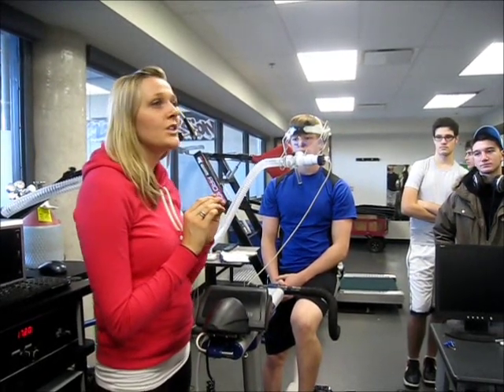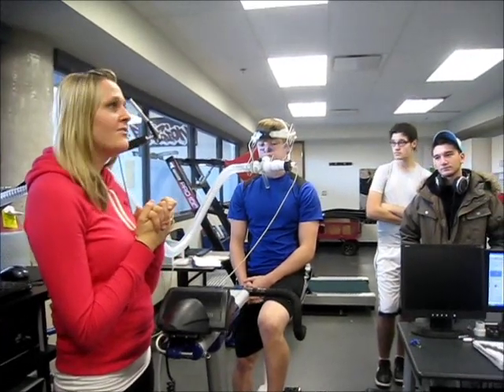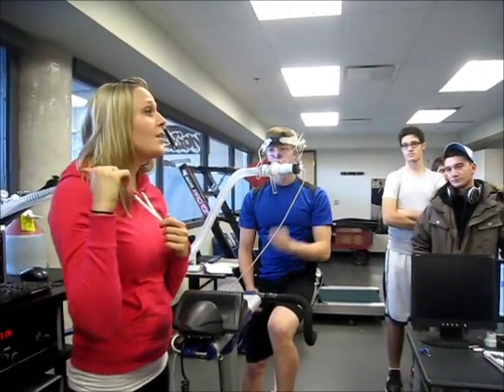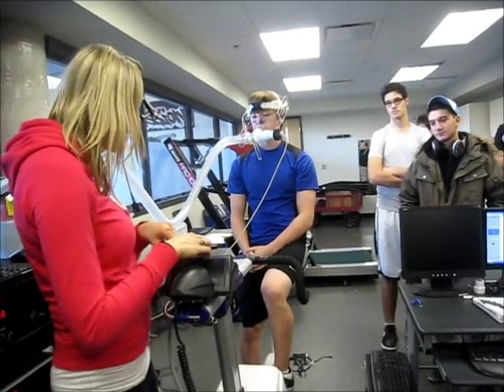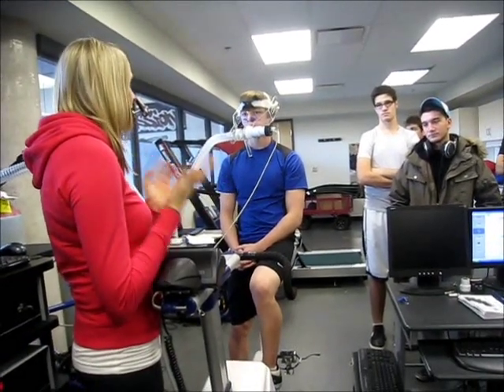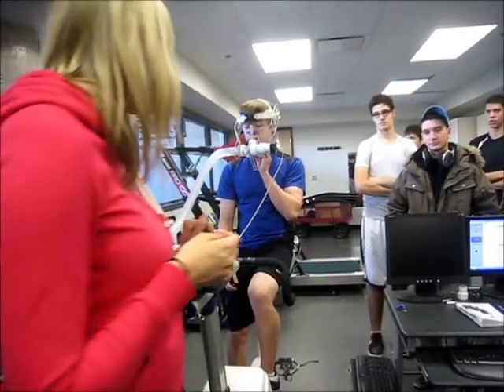After that, the workload is going to go up by 1 watt every 2 seconds, so it's going to be very gradual. He's not going to feel it at first, but eventually it'll start getting more difficult — and that's when he'll need us all to cheer him on. I'll be able to point out the values on the graphs. Daniel's job is just to watch RPM — make sure it's always above 50. People usually get comfortable around 70 to 90 RPM, but make sure it stays above 50.